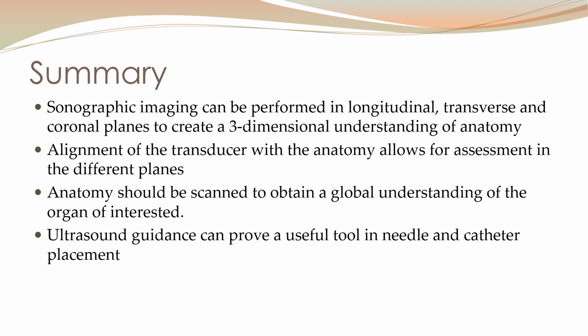The habit, when you see some really ugly pathology, is to just focus on that pathology. And we teach our sonography students, and it probably would benefit any practitioner, that before you ever think about taking a picture, if you're looking at one particular organ, you're going to scan through that organ first, getting your global orientation, taking stock of what's there before ever imaging or making any full determinations about what you're seeing. Focusing in on just one little component can really limit some of the benefits of the procedure.